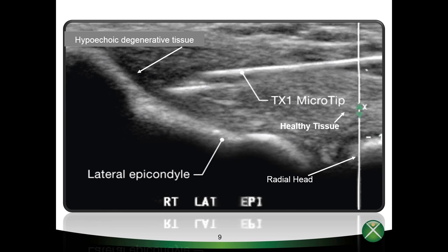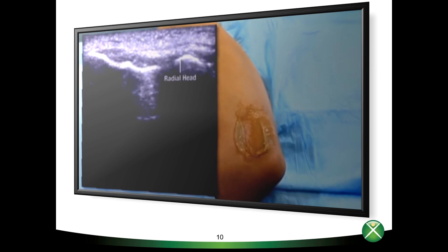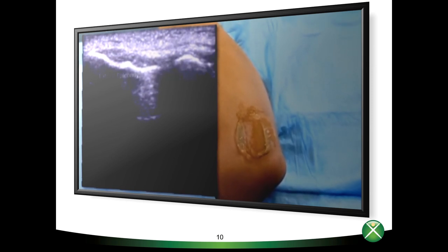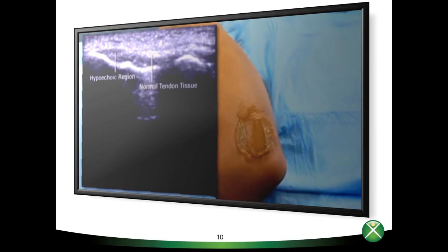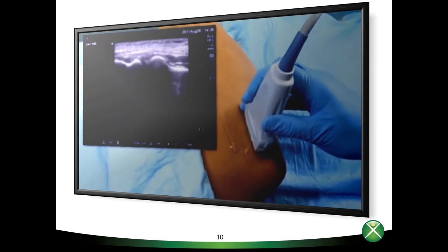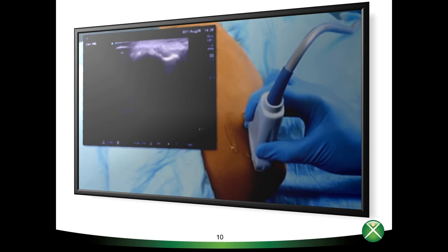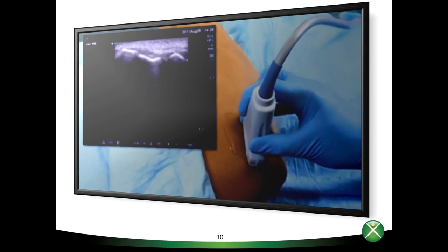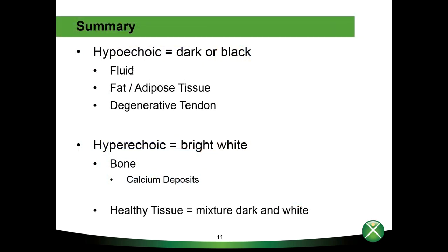Now let's watch a live ultrasound examination being performed on an elbow. On the right side of the screen you see the radial head, the joint space, and on the left side the bony landmark — the lateral epicondyle — in a very hyperechoic fashion. At the crest of the epicondyle you can see regions of disease demonstrated by a hypoechoic focal area, with thinning of the tendon tissue. In the longitudinal exam, identifying the radial head, joint space, and capitellum of the epicondyle, moving proximally you can see the contour of the epicondyle and the disease showing up as a hypoechoic area.